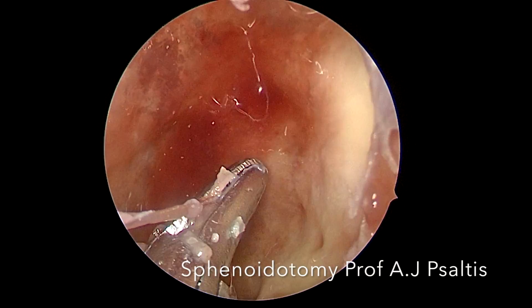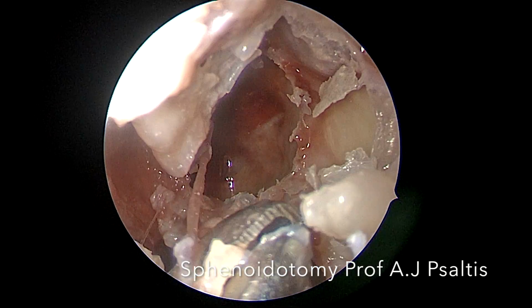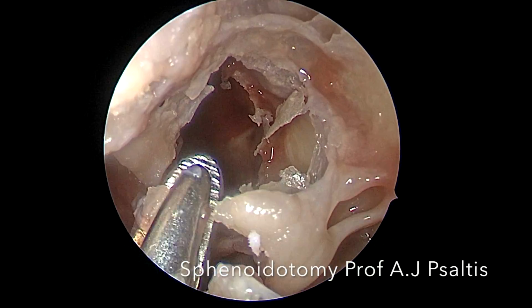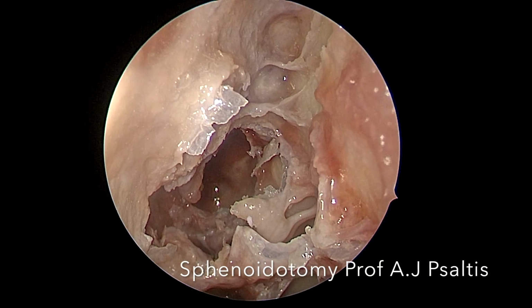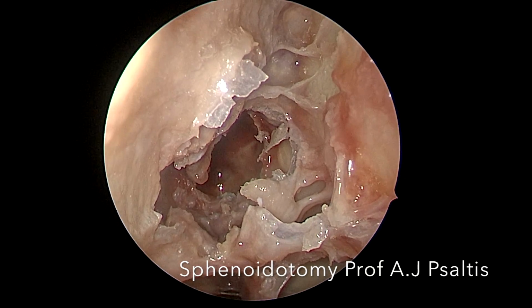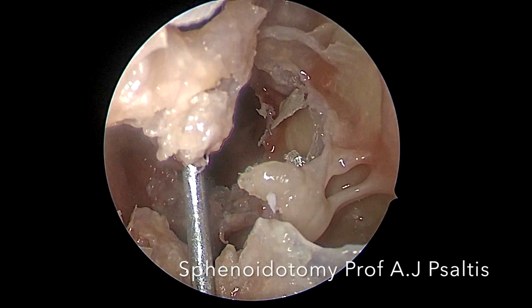Here we can see the optic nerve coming into view. The carotid artery sits lower and more lateral, and there is an opticocarotid recess between the two. Once this has been performed, we can then complete the finishing touches of the ethmoidectomy. It is important to remove the basal lamella up to the superior and the middle turbinate, as disease can often hide here and increase the recurrence of polyposis.